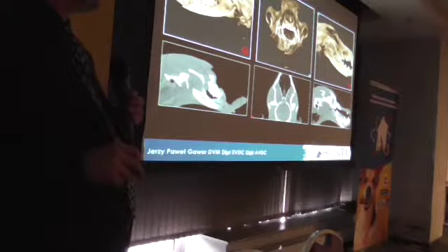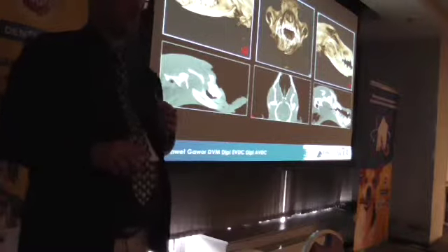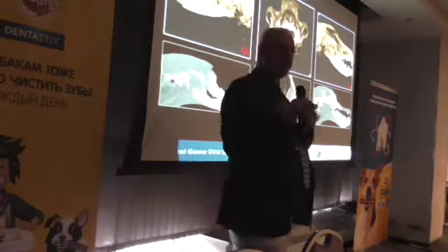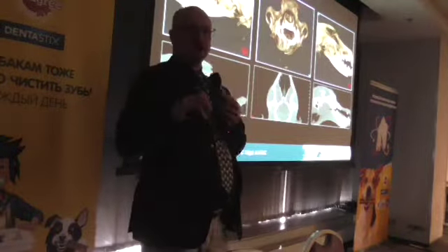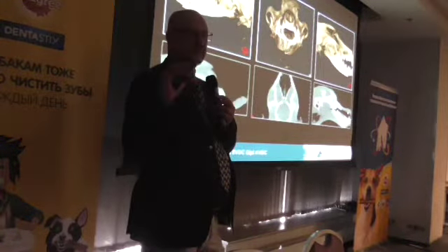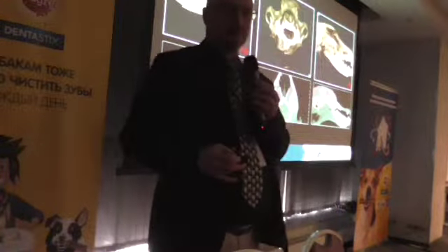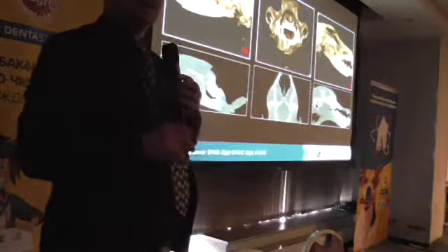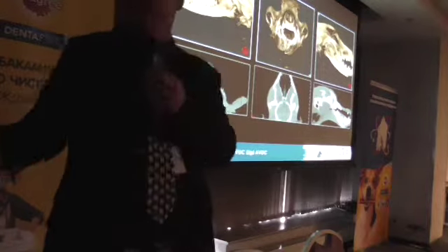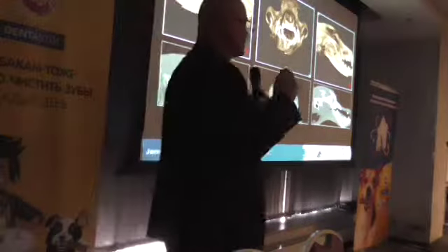Head trauma requires us to minimize anesthesia time. So we try to postpone the anesthesia for 48 hours after trauma, and then we do the first scan of the head, which takes 36 seconds. We collect the feedback and study the imaging, and after 36 seconds we can obtain this amount of information.